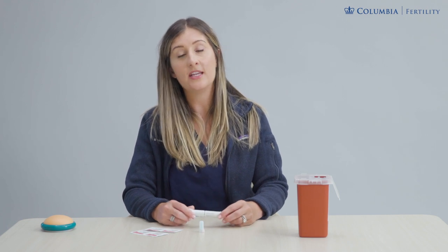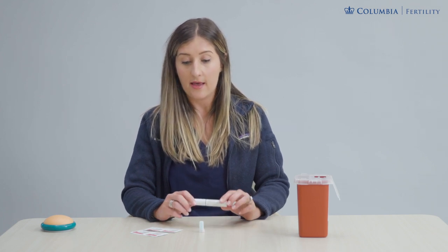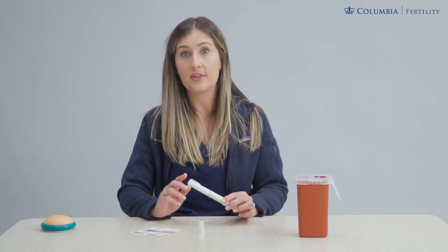Hi and welcome to the Gonal F Readyject Pen instructional video. We're going to review everything you need for tonight's dose. First off, confirm with your care team your dose for this evening in units, and then we'll gather everything that we need for the injection.